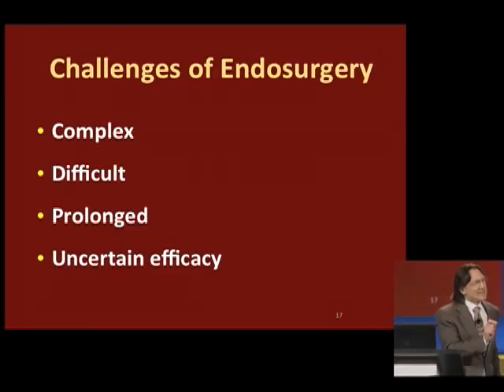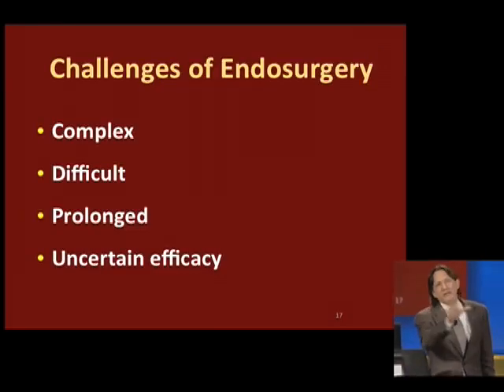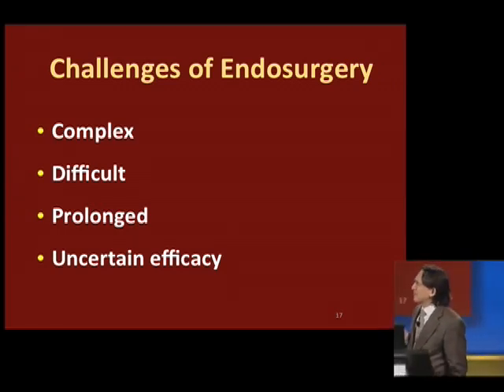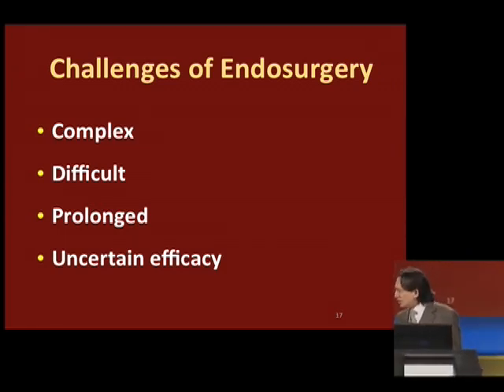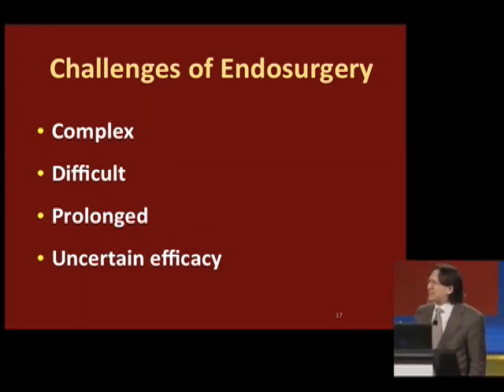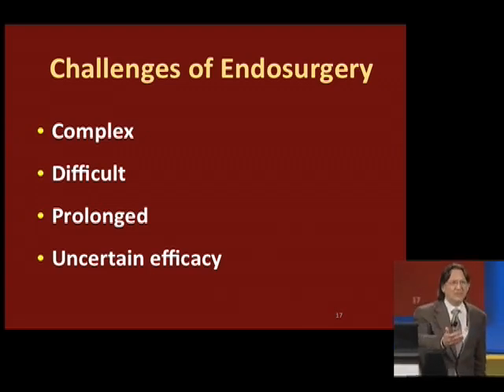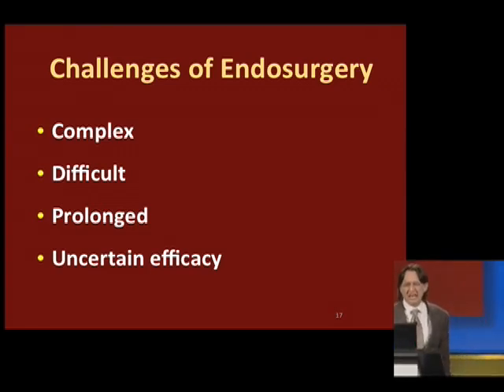But then, when all of this new technology actually entered the clinical arena, the doctors started to use these tools. We found that these were really very complex tools. They're difficult to deploy. They required specialized training. There were prolonged procedures, an hour or more, with the general anesthesiologist usually.